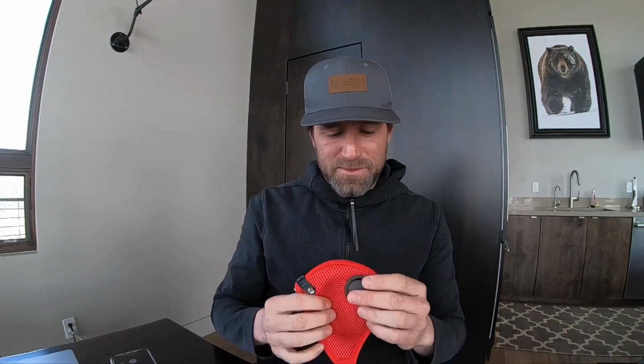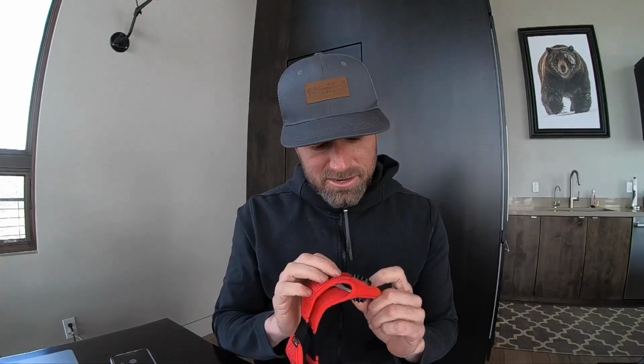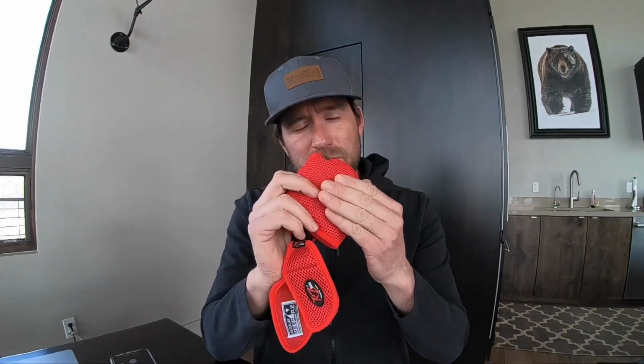You're probably wondering what these two things are. I'll get to that now. So these are valves. The idea here is there's a membrane inside. When you breathe out, the valve opens up. As you can see, there's a space in there. This will come open, allowing your breath to exhale. When you inhale, that little membrane sticks to it and basically blocks these valves, making zero air able to pass through, forcing any air you breathe to come through here, which is all covered by the filter.